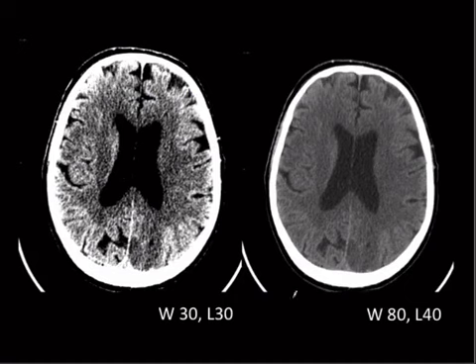Got a stroke window and a regular brain window. At the bottom of the screen, a lot of times you'll see this W30, L30, your window width and your level. So what does that actually mean? Let me sort of draw this out. Your level is selected at the attenuation of the thing you're interested in. So white matter and gray matter are around 30 and 35.